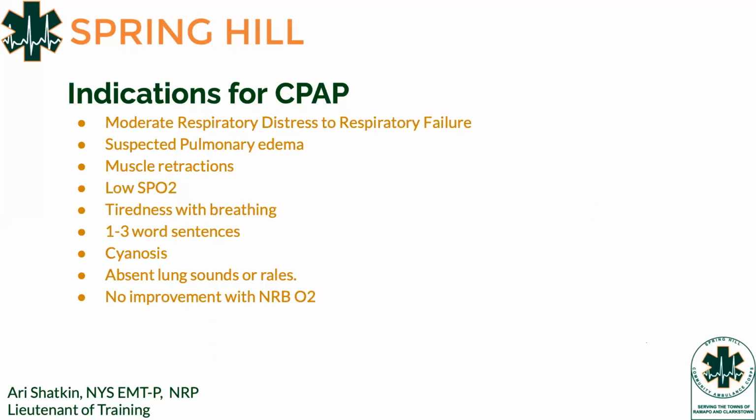All right, so our indications for CPAP. Patients who would be candidates are usually in the moderate respiratory distress to the respiratory failure scale. I know it's a large scale, but that's because really CPAP works for almost everybody. If you hear a lot of secretions that can't be cleared with a cough, like we were listening before, so you have a lot of wheezing, a lot of rales, a lot of rhonchi, and they're not clearing it by coughing. You guys think about it. Your positive airway pressure is going to force these secretions out of the way. It's going to provide a benefit.